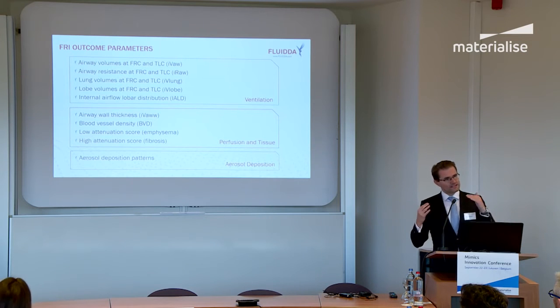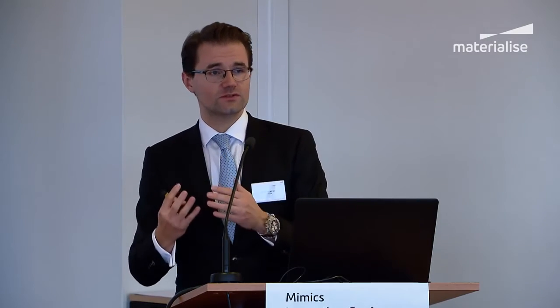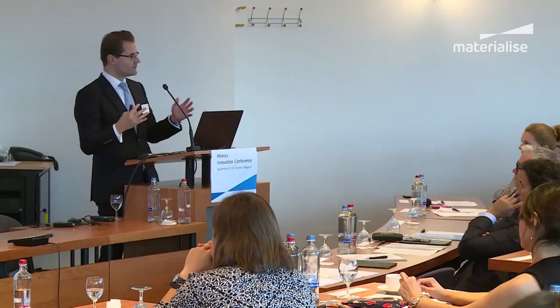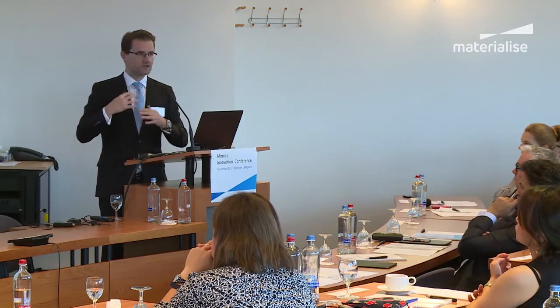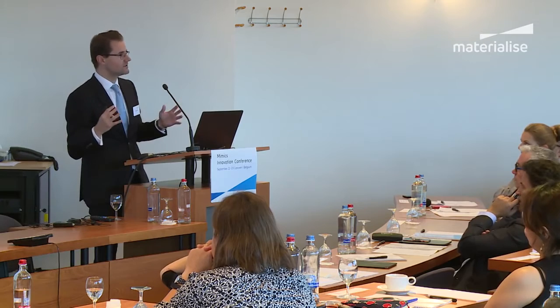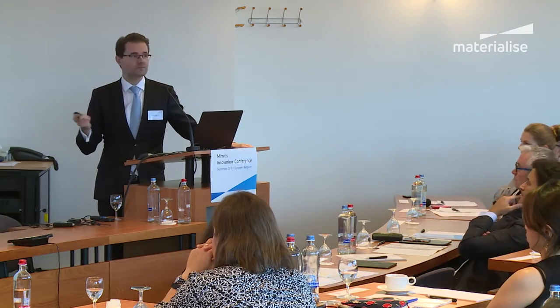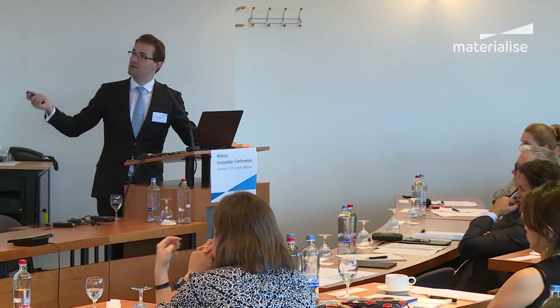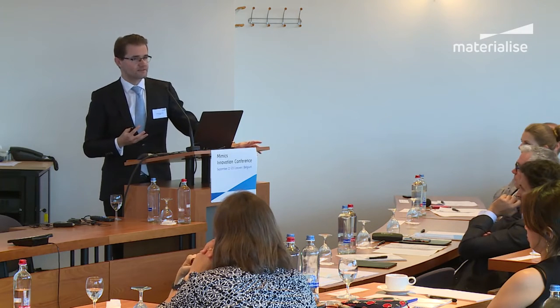And the beauty is that all these parameters are actually coming from the same source. So you have one source of variability, because if you want to use other techniques to obtain similar parameters, you often have to use different measurement techniques, each with its own level of variability. You get variability on top of variability. You model the signal, and your sample size in your clinical trials becomes quite large. So if you have a better signal to noise by using the CT scan and then the whole range of outcome parameters, you can see more in smaller clinical trials.